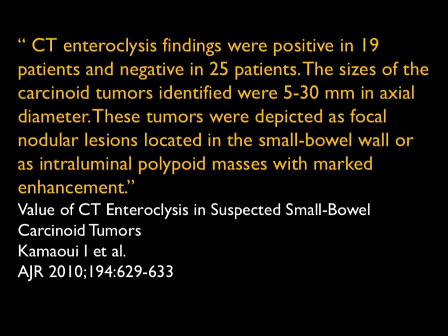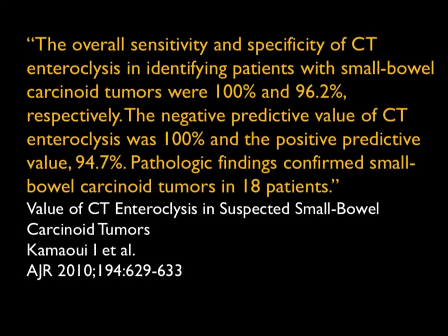If you want to know how good we can do, this was a study with CT enteroclysis, looking at tumors from 5 millimeters to 30 millimeters, and the CT enteroclysis was indeed very good. Sensitivity and specificity were 100 and 96.2%. Negative predictive value was 100%, and positive predictive value 94.7%. So you can see when studies are done carefully and correctly, CT is a wonderful examination.